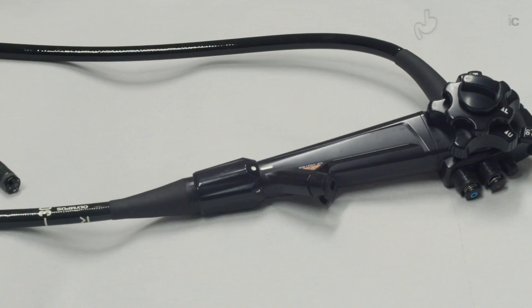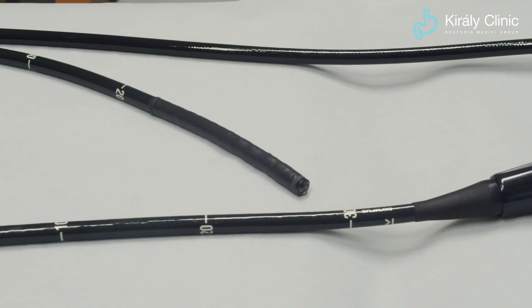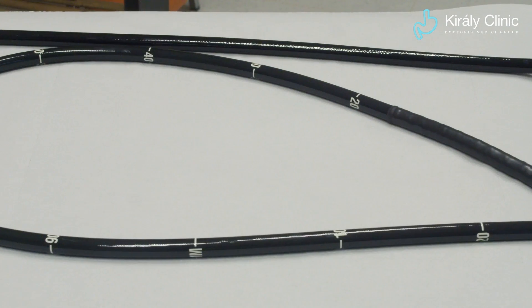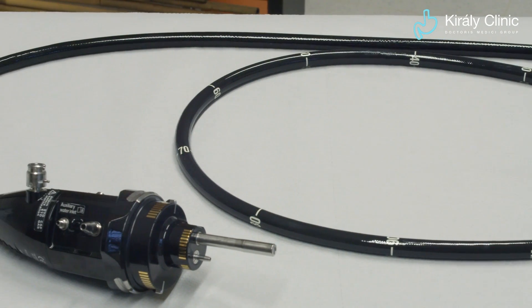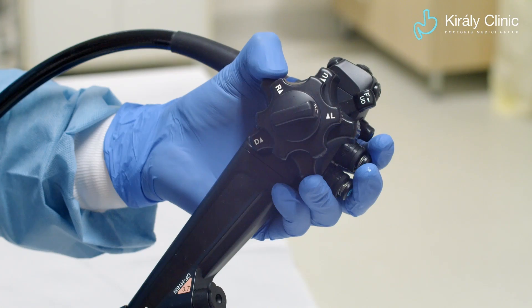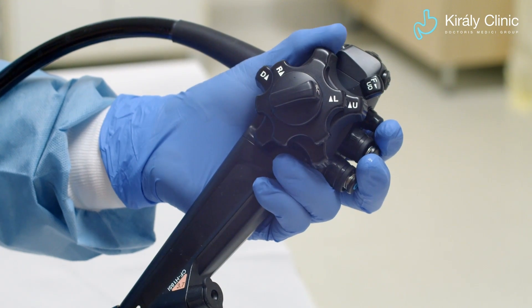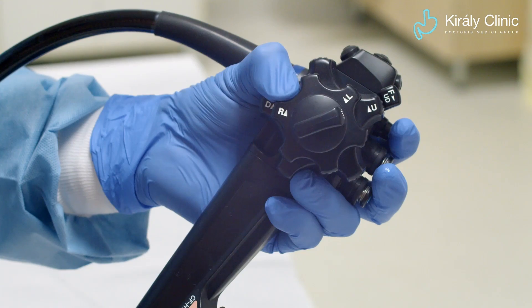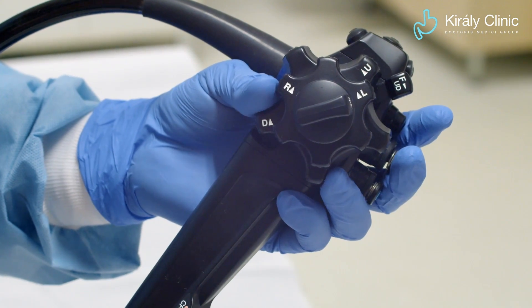The colonoscope is a 130 to 150 centimeter long flexible tube with a fiberoptic lens at the end. In some endoscopes, including this one, another lens moves behind in order to enlarge the image sufficiently to determine the fine structure. At the end of the handle of the colonoscope are the wheels that guide the tip of the colonoscope. The endoscope itself is moved or held in position by the examination staff — doctor or endoscopic assistant.